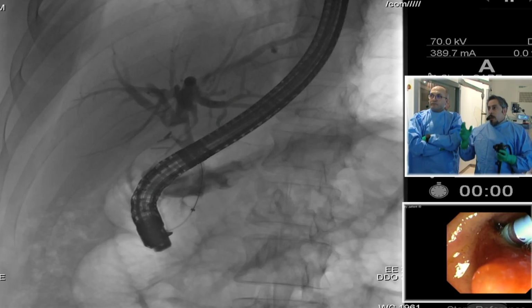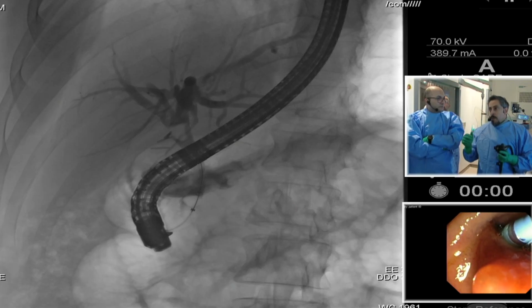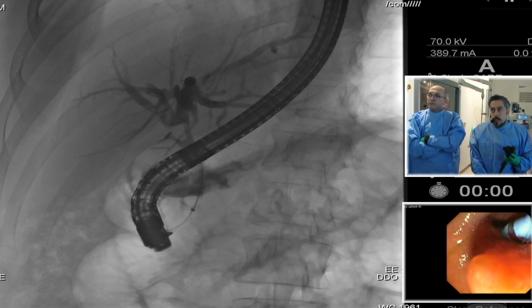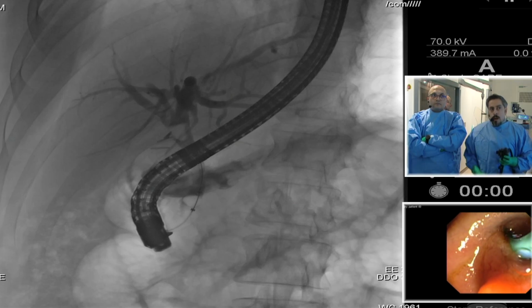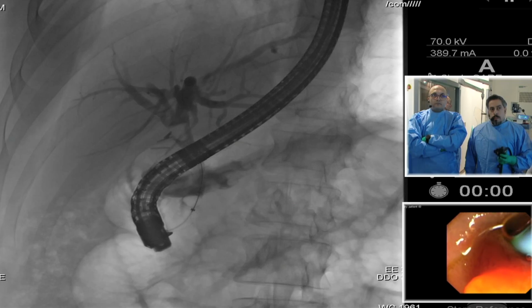Yeah, the question here is maybe we can see the stone. It's more mechanical lithotripsy. Square shaped, Dr. Albsher. So this is most likely a very difficult stone, and you will need maybe a laser lithotripsy, especially with the presence of a stricture distally. Is that the decision that you guys made for laser lithotripsy?